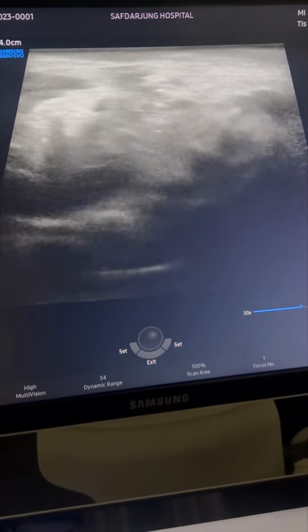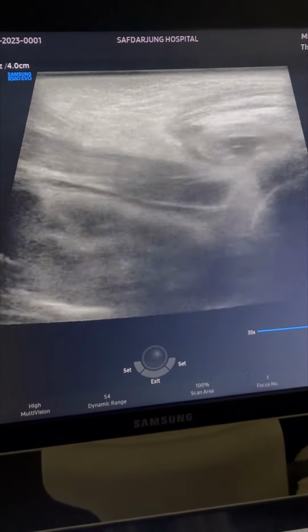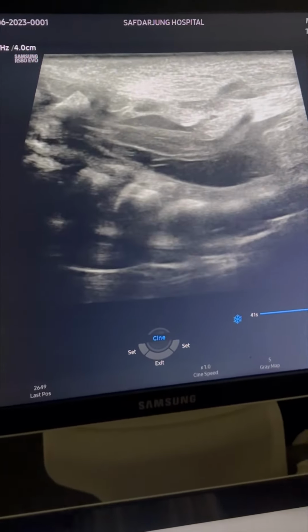The sacral vertebrae are normal. We have to look for sacral anomalies also. We have to always screen the brain of such patients for associated posterior fossa anomalies, and in this patient we found a small posterior fossa without any herniation.